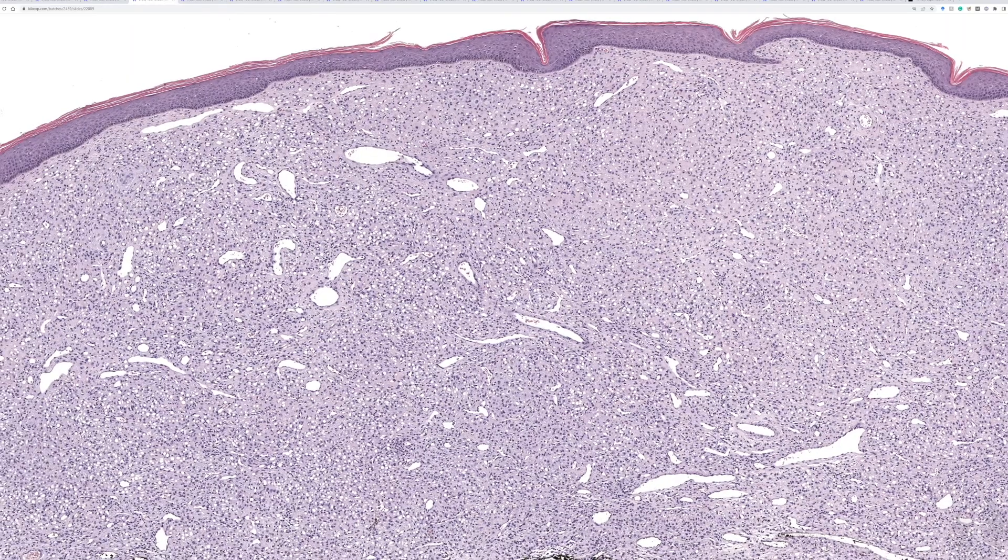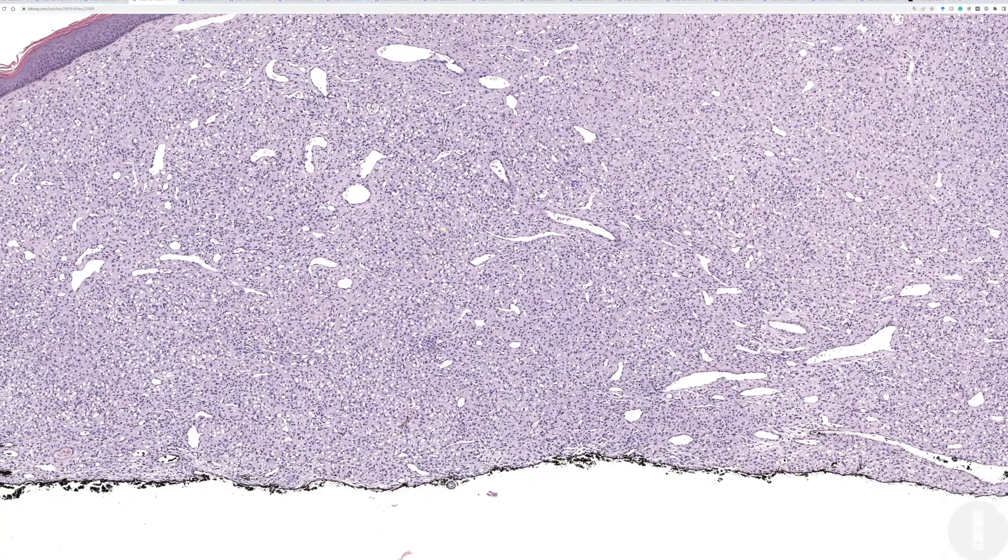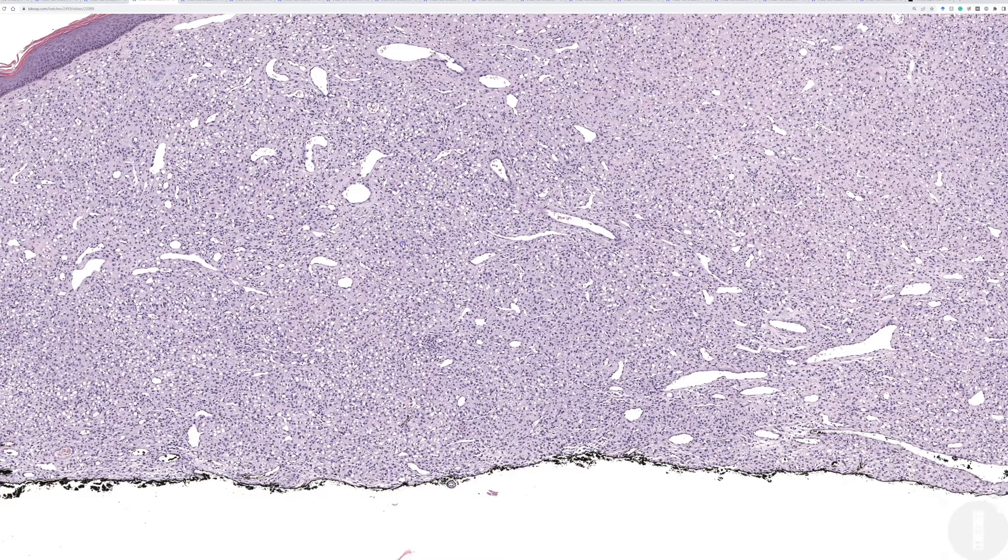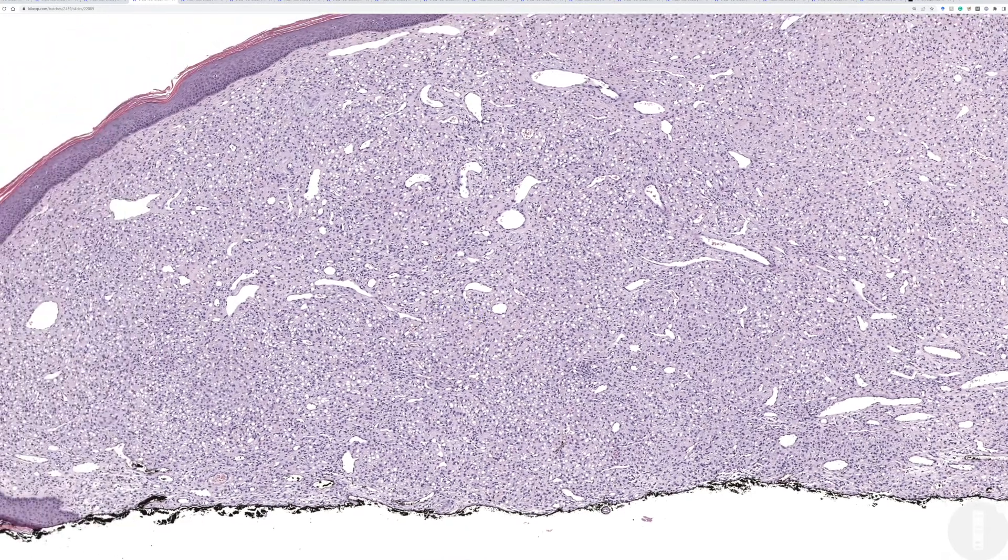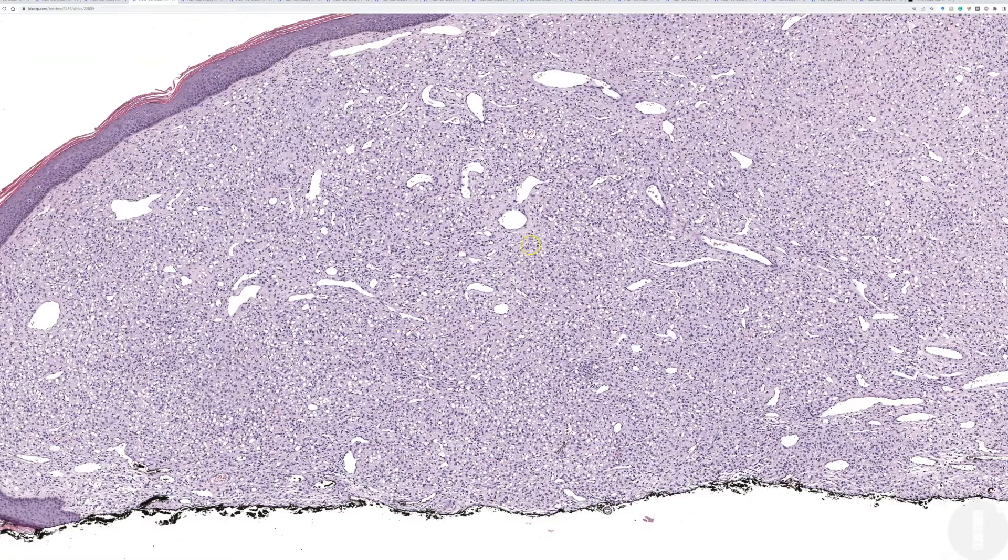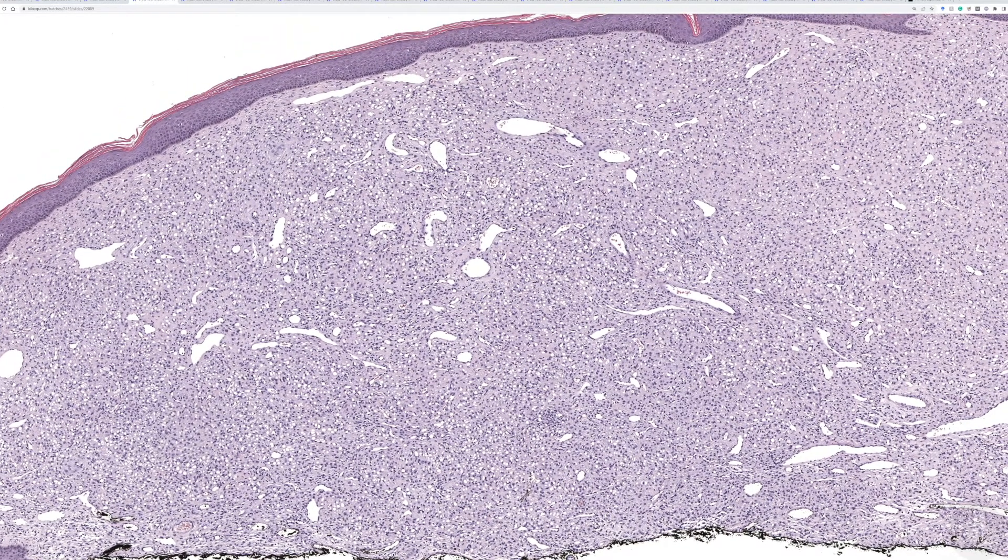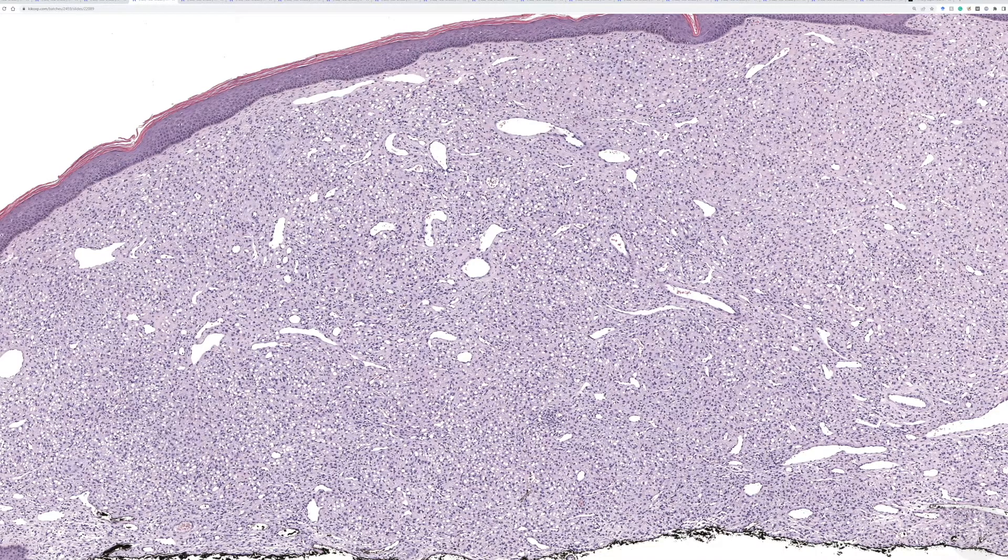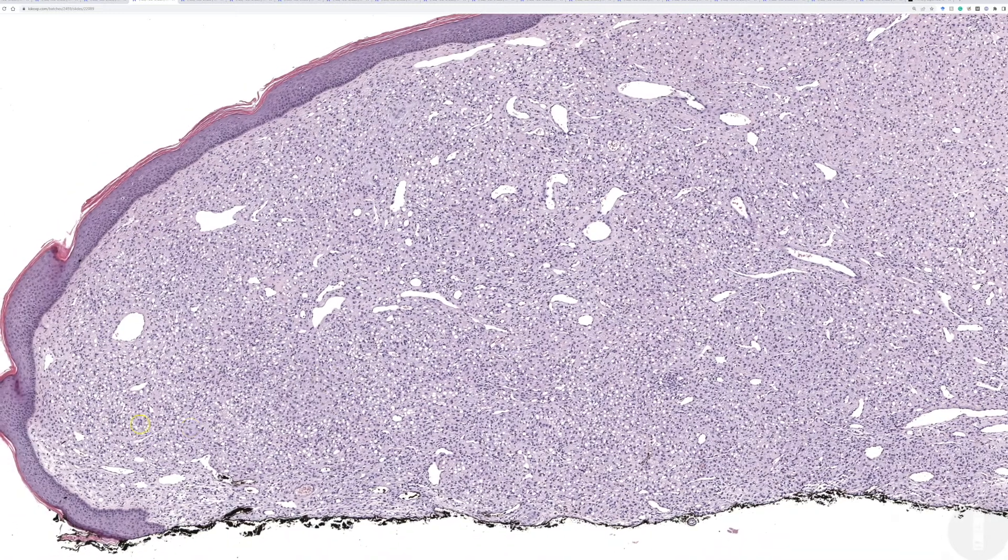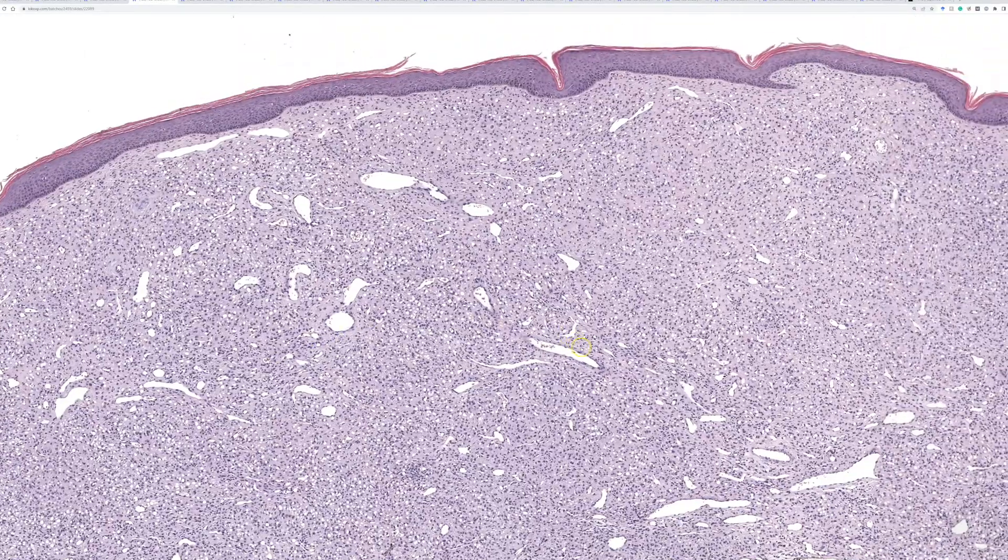An alternative name that had been proposed in the past was epithelioid cell histiocytoma. And these classically are made of epithelioid histiocytes, or histiocytoid cells, with a collagenous background, and this dome-shaped papule, usually with a collarette around it, and with dilated vessels.